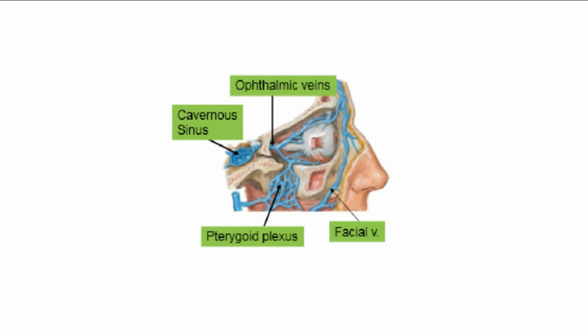So in this case, if you're doing the maxillary nerve block and you get in here, and if you reached the pterygoid plexus, for example, you will see blood coming out with your aspiration. This is called positive aspiration. So you're doing something wrong. You cannot inject. Pull your needle out and know that you went too far. Otherwise you will be injecting your anesthesia into one of the arteries or veins, which is a big problem. So that's why you have to do it.